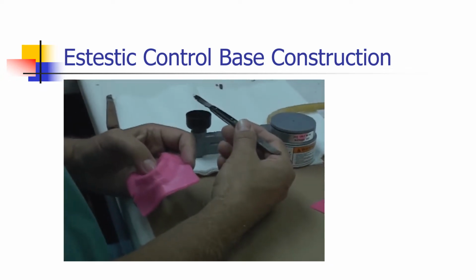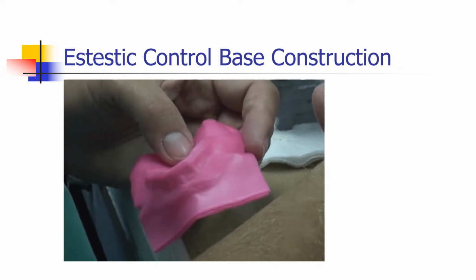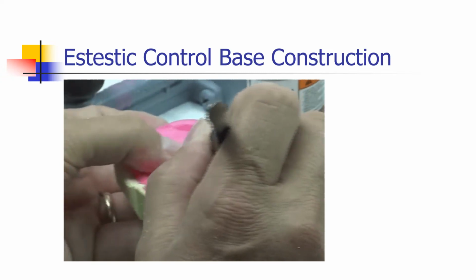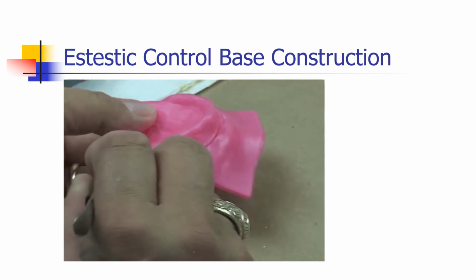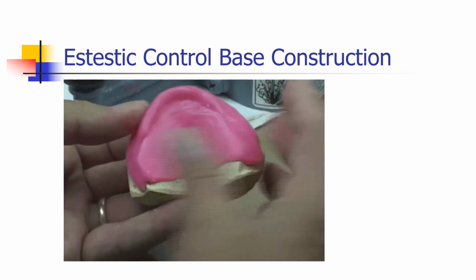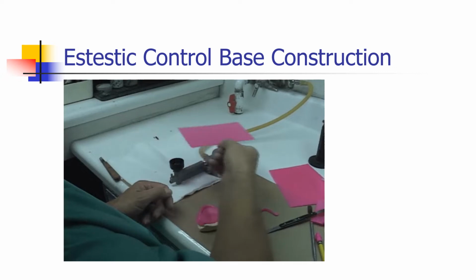Then we take a waxing instrument, this wooden handled waxing instrument, and just cut through the mucobuccal fold all the way around. We're going to leave the palate in for the try-in just so we have enough wax to have a solid base for try-in. Okay, that's the first wax that we apply to this model, and then the second wax sheet we're going to warm up, and then this is going to be folded in thirds.